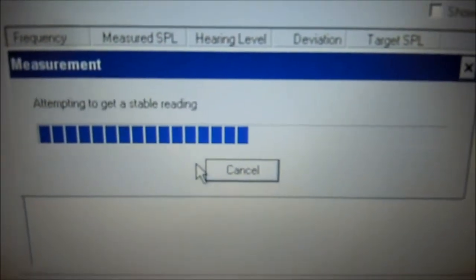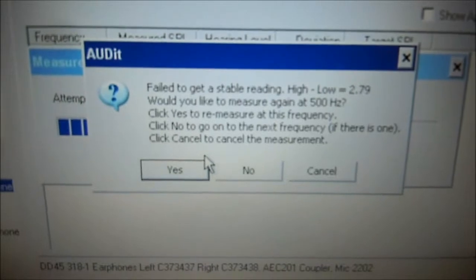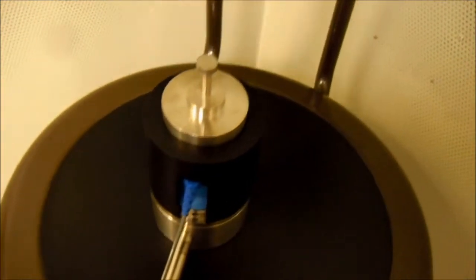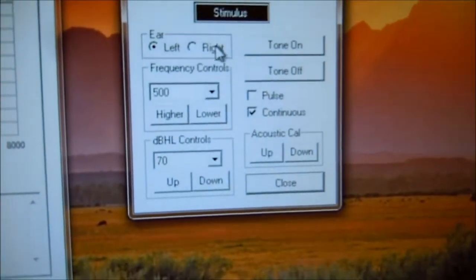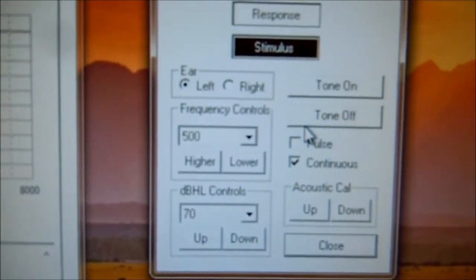It's performing its measurement. It says it failed to get a stable reading — would you like to measure the 500 Hz again? So let's check our setup again. We have our blue — our left is there, it's on the calibrator. Come back to our audiometer and check our settings. It was set to right; we need to set it to left. Our left is selected at 500 Hz, 70 dB, continuous tone, and the tone is already on.